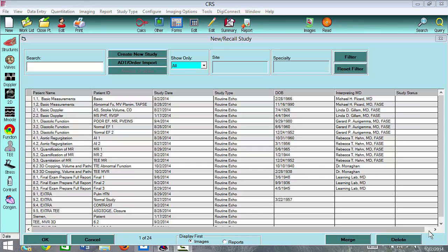Hi, this is Marti McCulloch, and we are going to briefly review the cases for the Echo Learning Lab on mitral regurgitation. There are 3 cases.